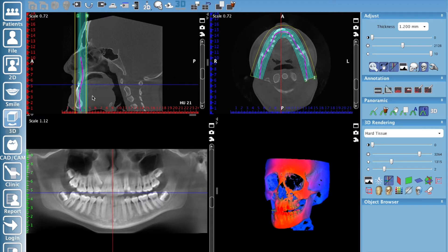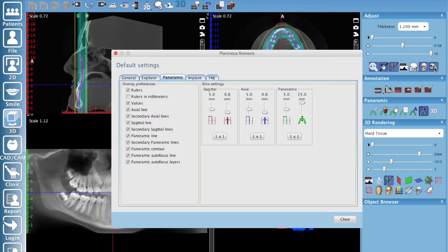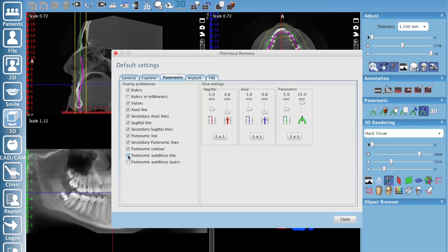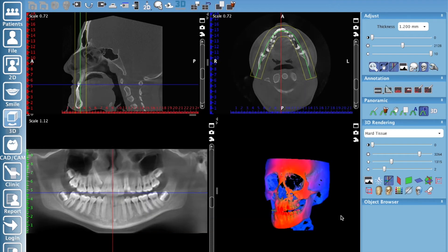You'll see these lines with your layers and layer lines. You can turn those off if they're impeding your vision — that's under the wrench icon, which is your default views. Click on that, make sure you're on the panoramic tab, and you'll see auto focus, layers, and line. If you hit layers it turns them off so you can see a little better. Click the autofocus line and that's gone as well. That's how I set up my default settings in Romexis for the panoramic sub-module.